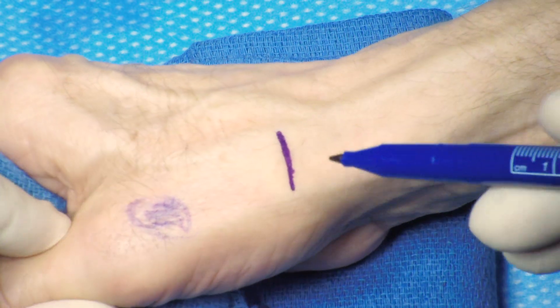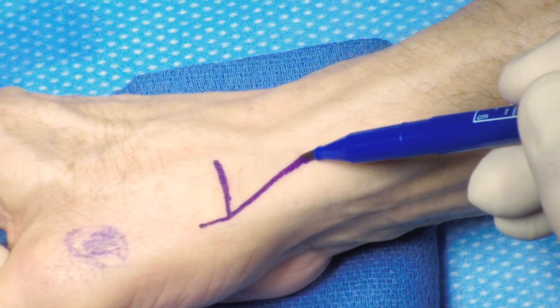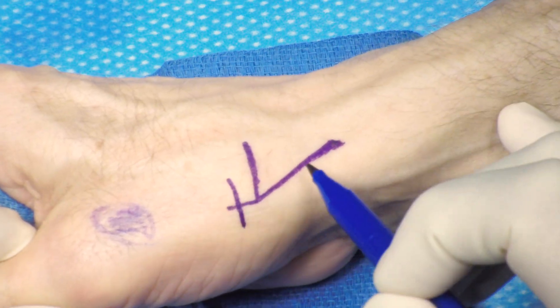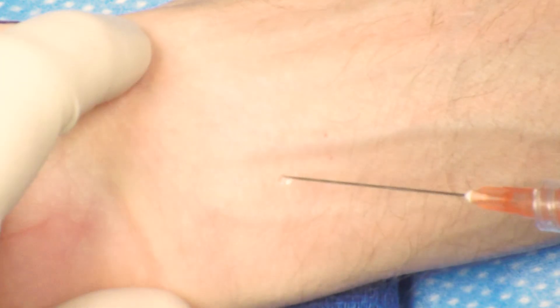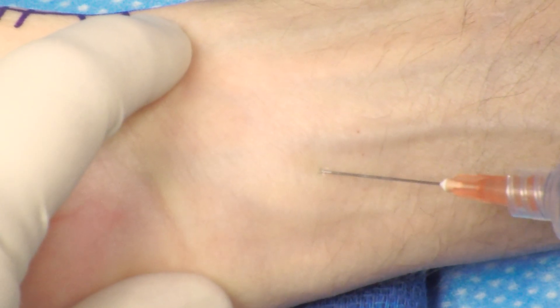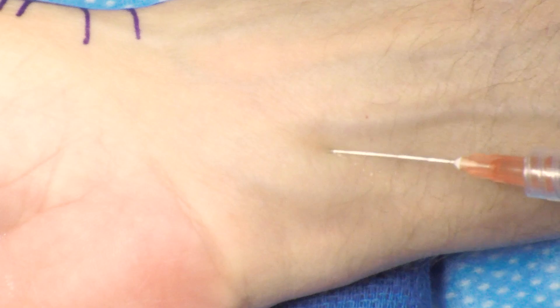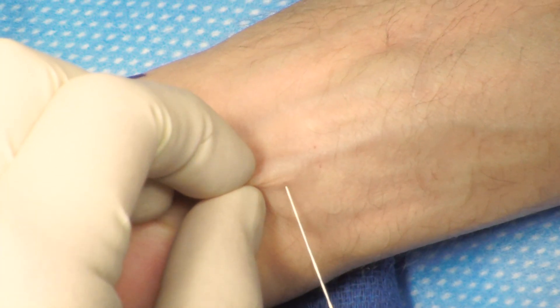The basal joint is marked. The incision is started at the radial base of the first metacarpal, almost at the junction of the glabrous and non-glabrous skin. The incision is then taken dorsally. The procedure is performed with sedation, as well as a median nerve block and a superficial ring block over the radial aspect of the wrist.